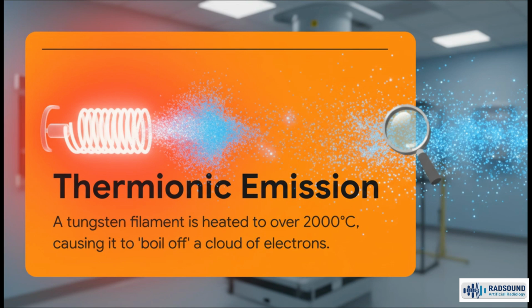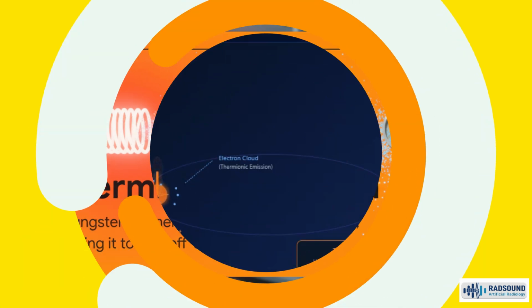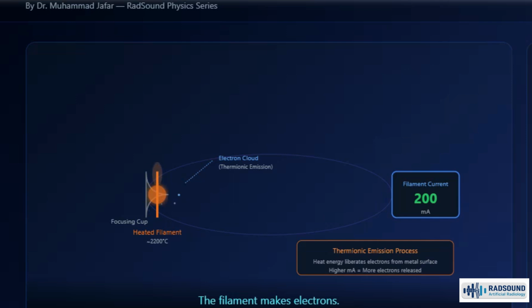Okay, step 1, we gotta make the electrons. This process has a fancy name, thermionic emission, but the idea is simple. Think of a light bulb filament. We take a tiny tungsten wire, we heat it up to over 2,000 degrees Celsius, and it literally starts to boil off a cloud of electrons. Just like that, you've got this little cloud of potential just waiting to be used.